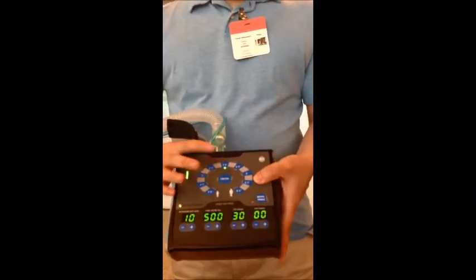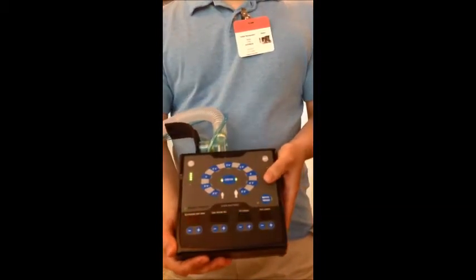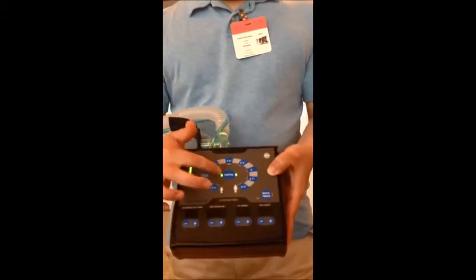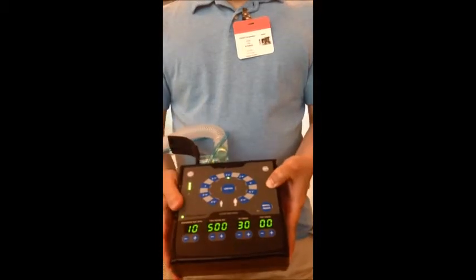When we select a height, the device will now display the respiratory rate, tidal volume, peak inspiratory pressure, and the PEEP, the safe settings for this particular patient. It'll then prompt the user to confirm this setting. Once they confirm, it'll start delivering.